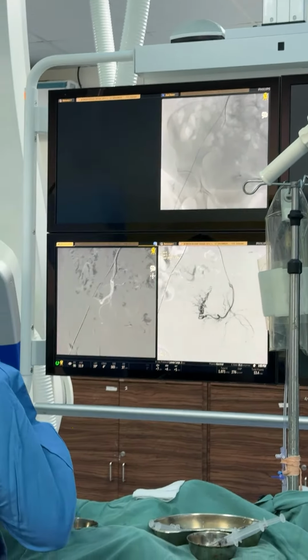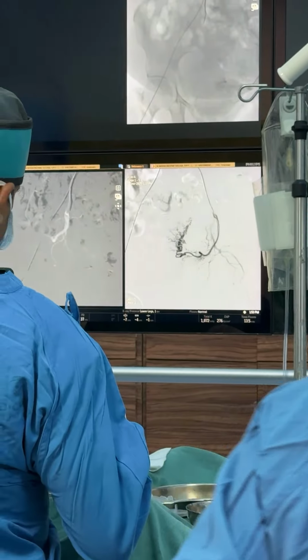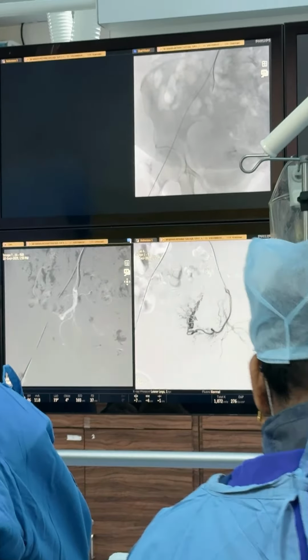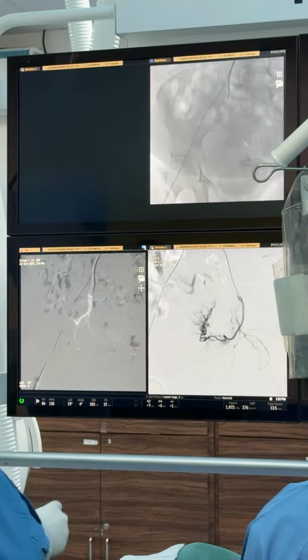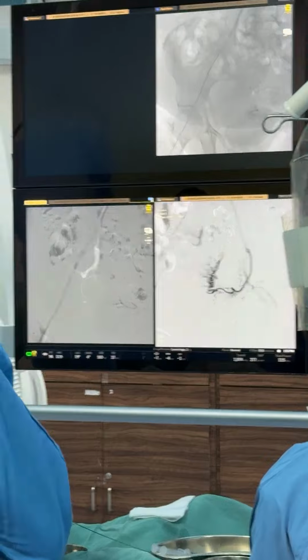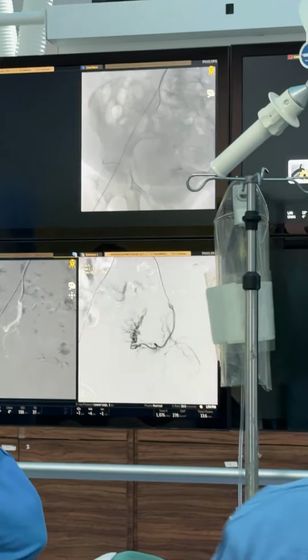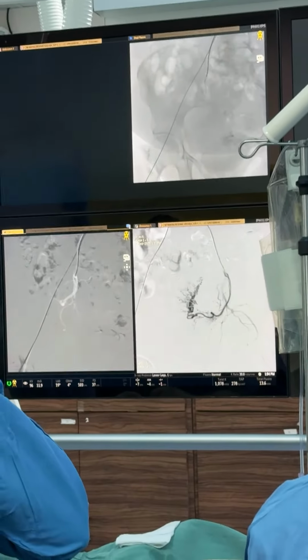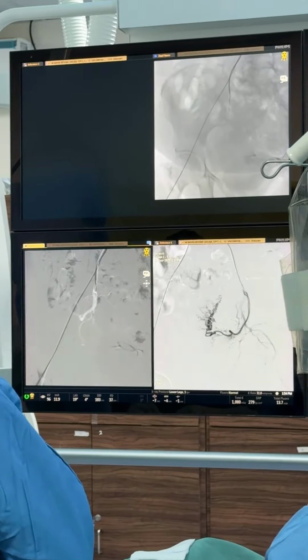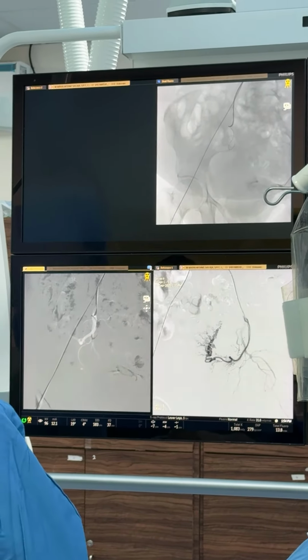Easy. Give me the wire. So it can play a little bit of a trick on you. So it's better you take the wire, which will also help us straighten this catheter because we make a lot of twists and turns.